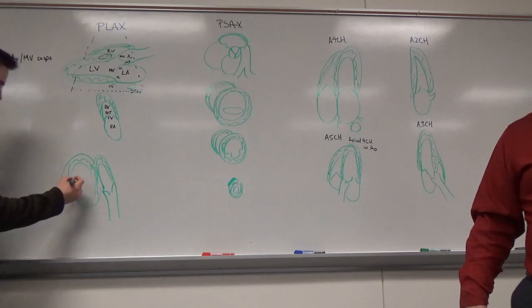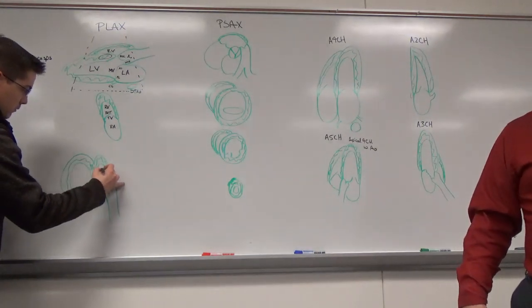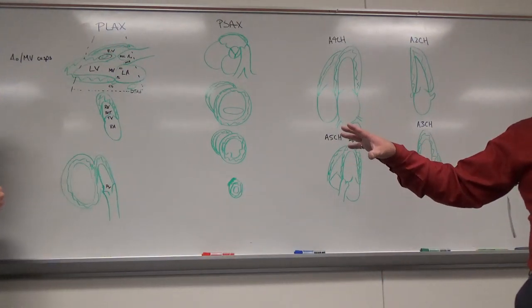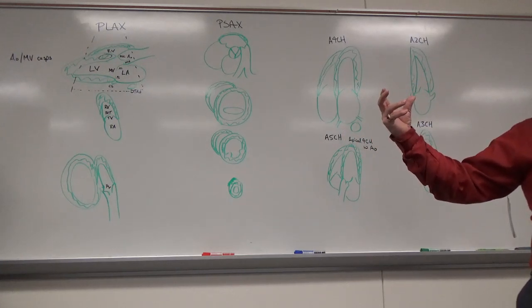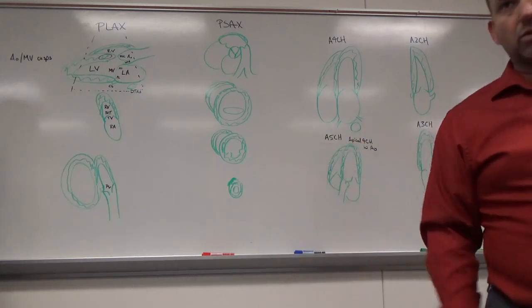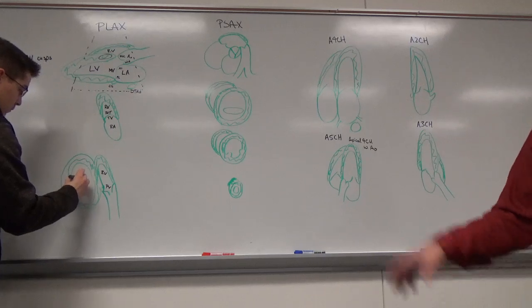Pulmonary. So that's the pulmonary valve we're going for. Okay, and then on top of that, I'm drawing in the muscle a little bit thicker as well, so you kind of clue in that this is muscle, it's thicker, that's not a vessel, it's the muscle of the wall. So that's right ventricle there. And I drew in the left ventricle.